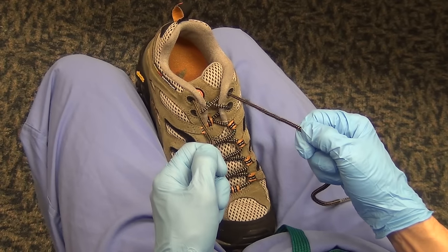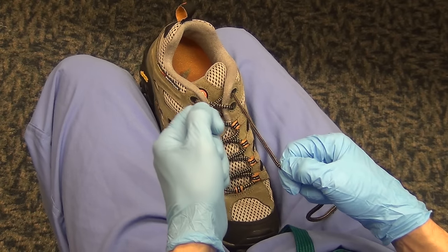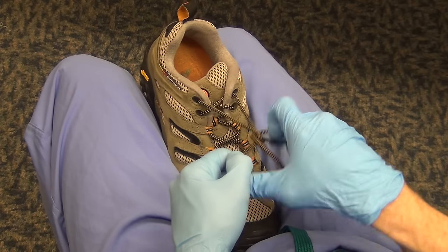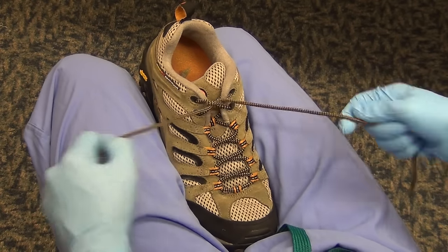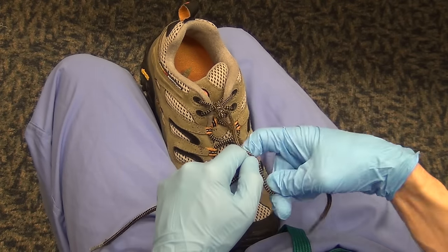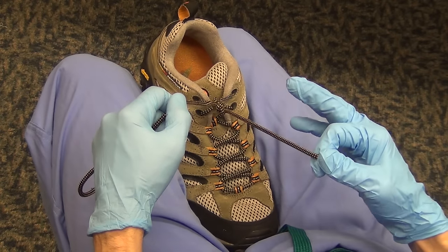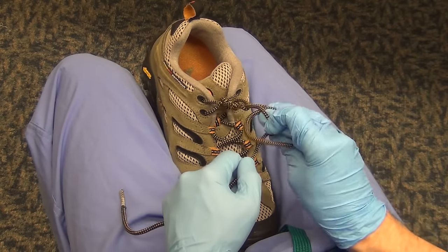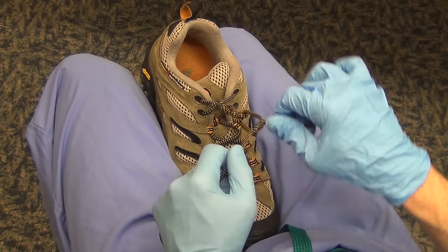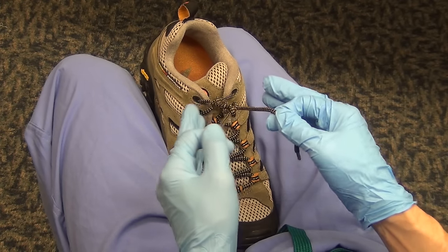Now an introduction to one-handed knots. One-handed knots are useful if you've got something on one of your suture ends or if you're in a tight space. You can tie one-handed knots as square knots as long as you alternate back and forth between what I call the karate chop and the figure four, and pay attention to crossing up and down as you tie your knots.